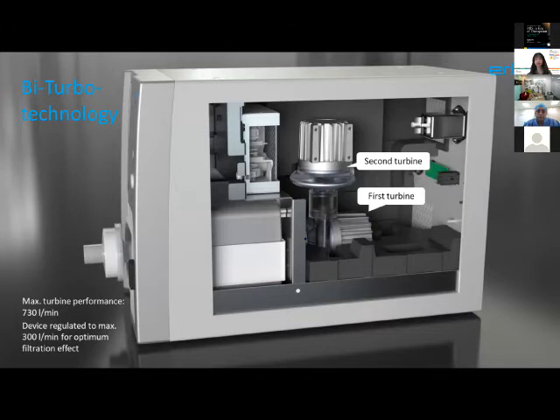But this airflow doesn't really consider as a big factor, because what happens as you increase the flow rate for air filtration, you actually decrease the efficiency of how the filtration works. So the IES caps it at 300 liters per minute because this is what the optimal filtration effect was determined at. If you're going to go at higher, these particles are just going to zoom through because of that high flow rate.